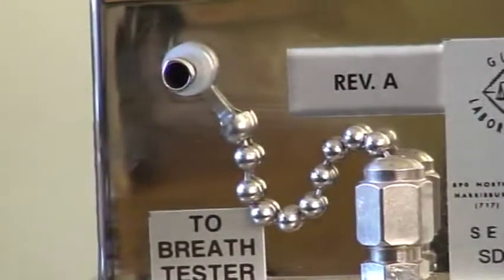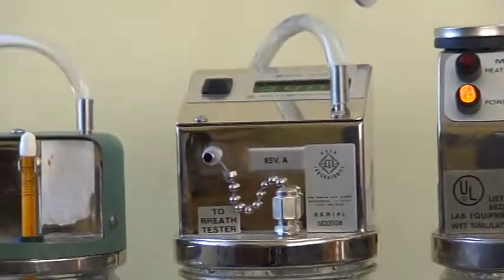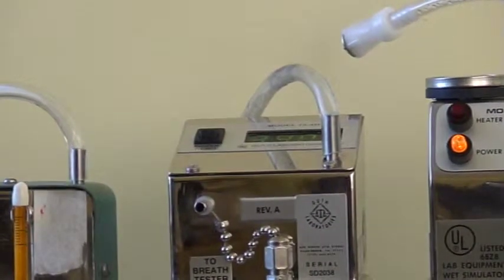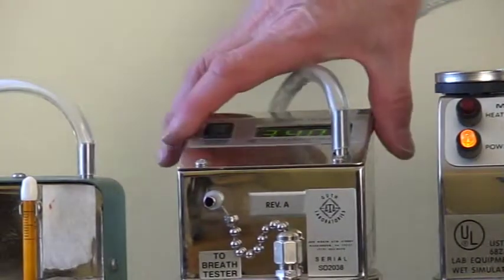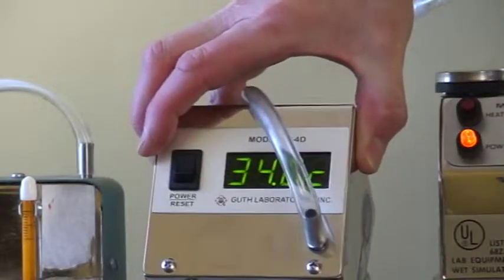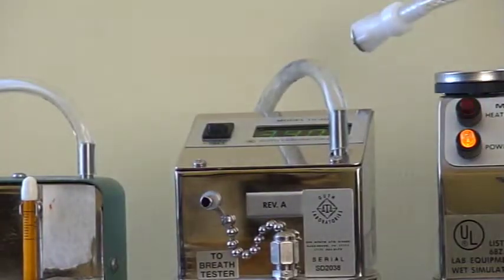Beside it is another Guth simulator. This one has a digital display up on top. I'm just going to move to turn it over sideways so that you can see it. You can see it has a digital display showing 34.0 degrees Celsius.